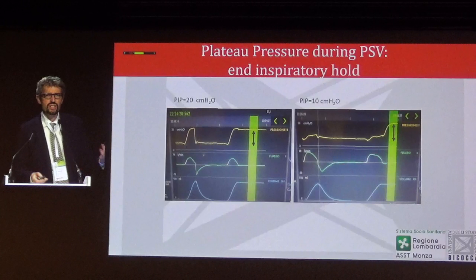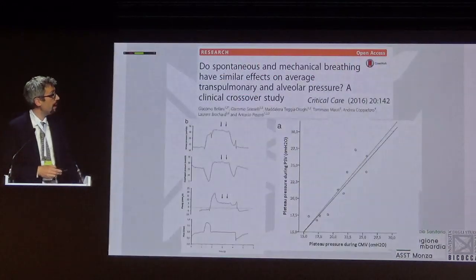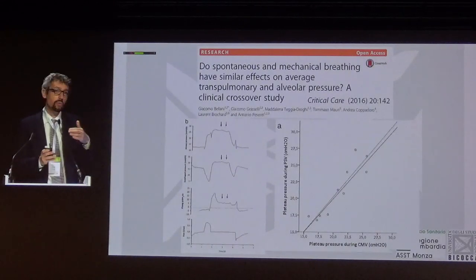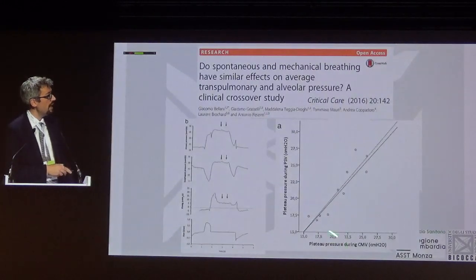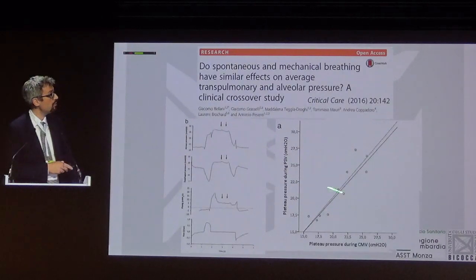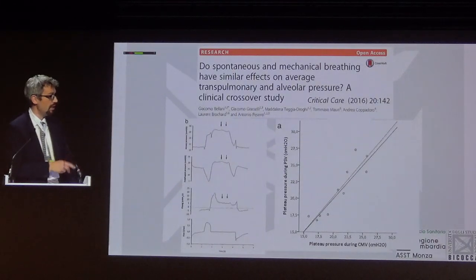Is this just an idea? We believe it is a little bit more than that. We published a few years ago a validation study, which is a reanalysis of another study, in which the patients were switched at some point from passive controlled mechanical ventilation to pressure support ventilation. And as you can see, if tidal volume is kept constant, the plateau pressure which you measure during the two conditions is very similar, close to the line of identity.